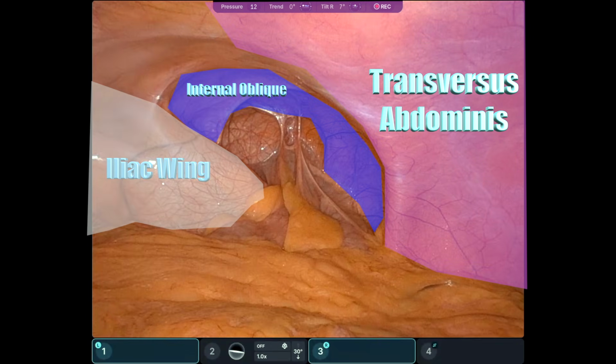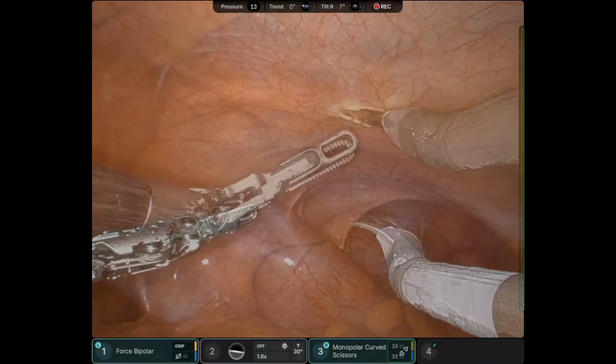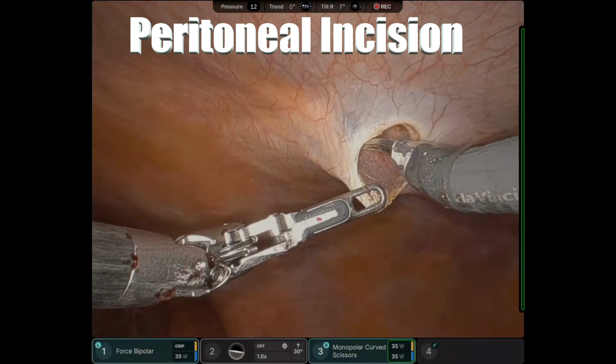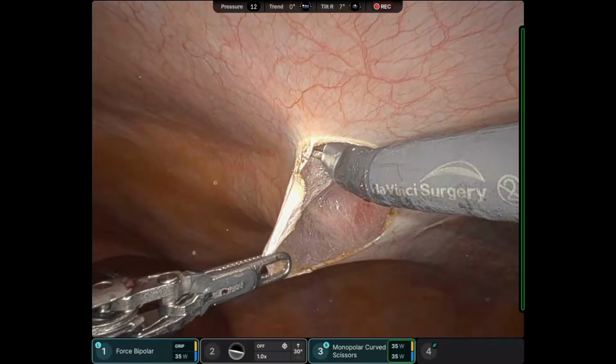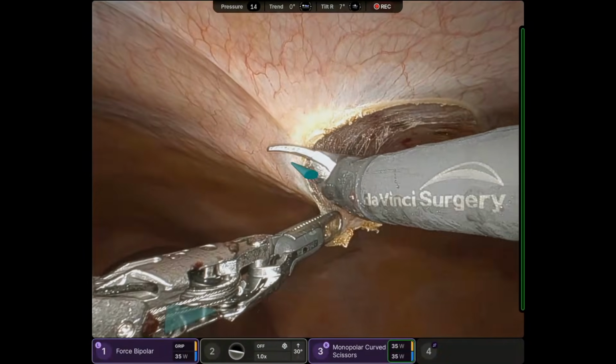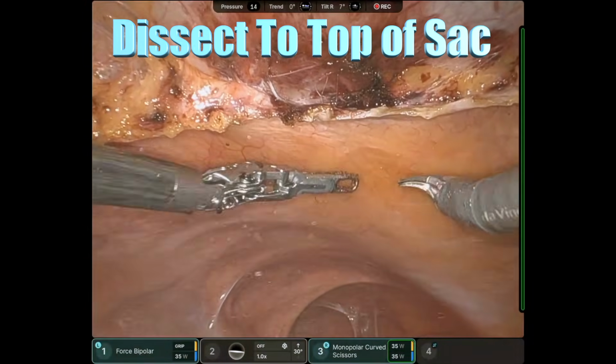This was the initial laparoscopic appearance of the hernia defect. Patient had some ascending colon sliding into that hernia, so I knew reduction of that colonic segment would be accomplished with preperitoneal dissection, reduction of hernia sac.